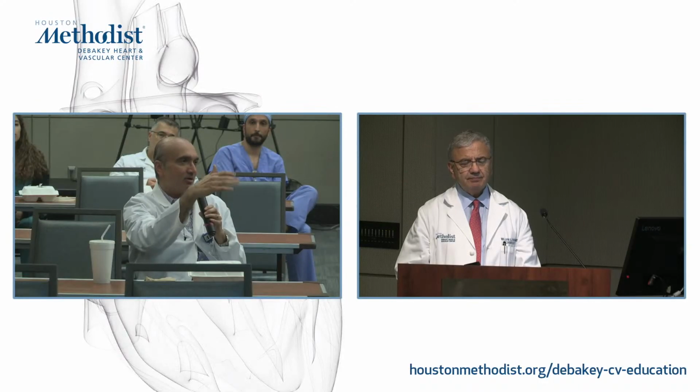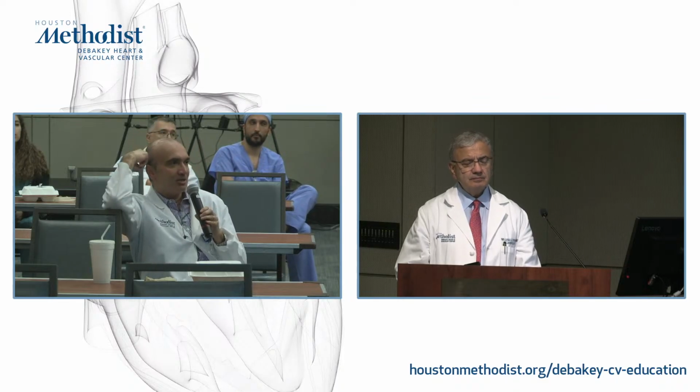And it's a ventricle that's very stiff. So in the post-TAVR AS patient, would you modulate how you define severe? Interested in your thoughts.